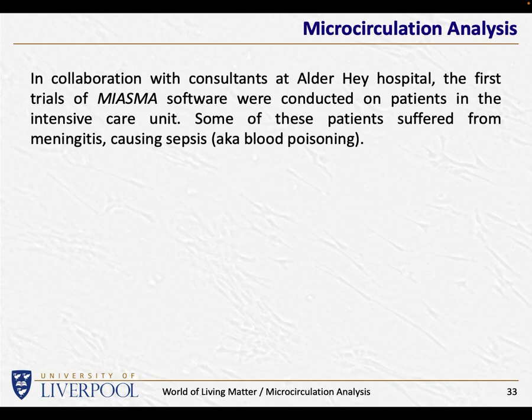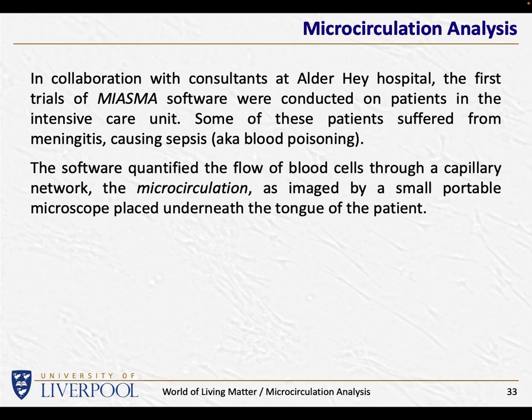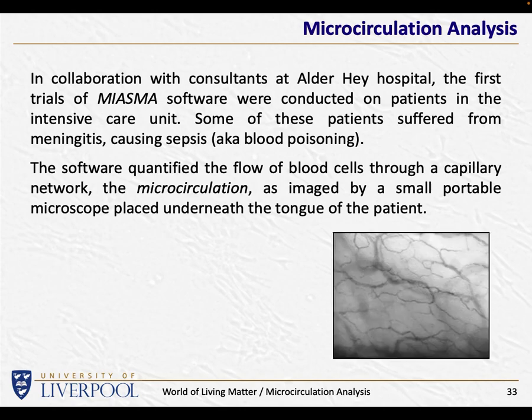Microcirculation analysis and cancer. With microcirculation analysis, I worked with people at Alder Hey Hospital looking at how blood is flowing through capillary networks, microcapillaries, the smallest capillaries, which is what we refer to as microcirculation. They had a small microscope which they placed under the tongue, so I can't speak and do this at the same time, that gives you access to the microcirculation without imposing too much of a problem on the human body.